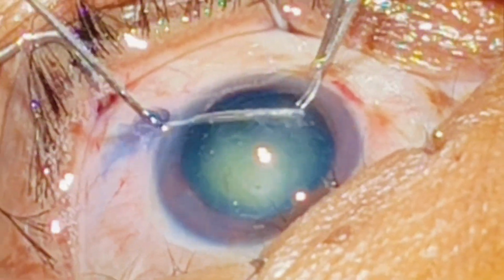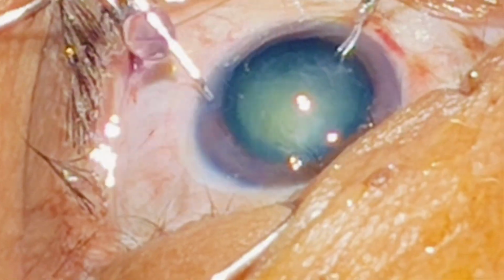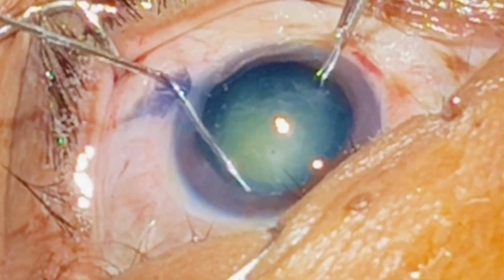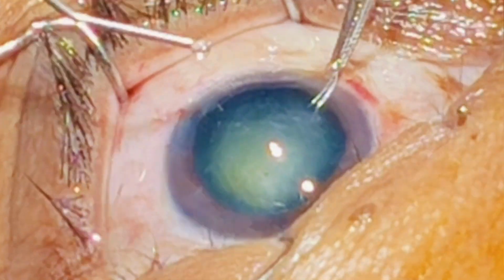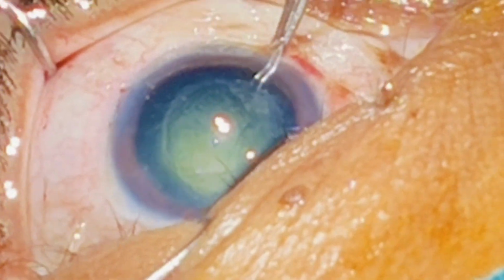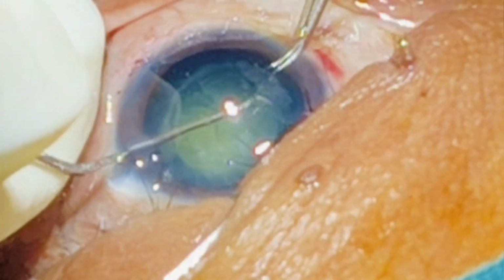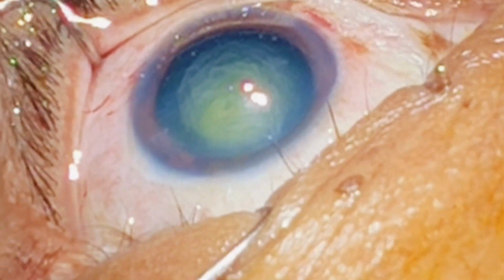Now we are doing hydrodissection, and that's a very key step for any cataract surgery. With a good hydrodissection we can free the nucleus from the surrounding attachments. Then we'll slightly rotate the nucleus so that it gets totally free from the adjacent attachments.